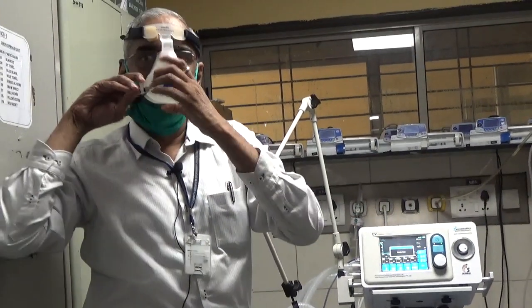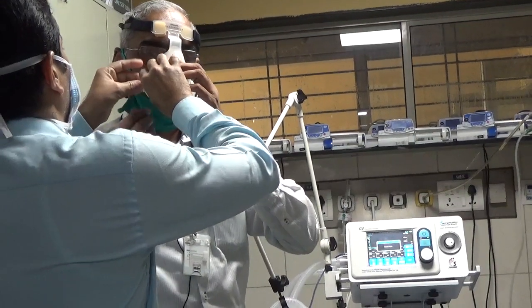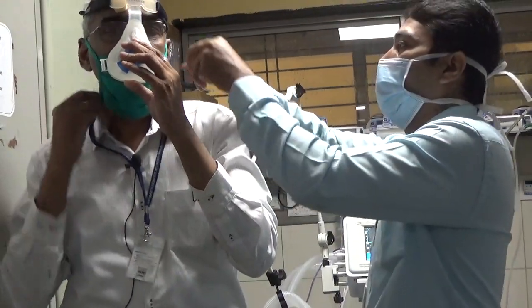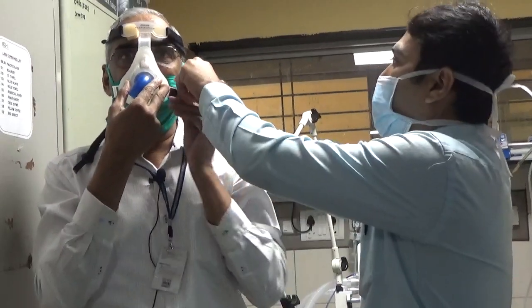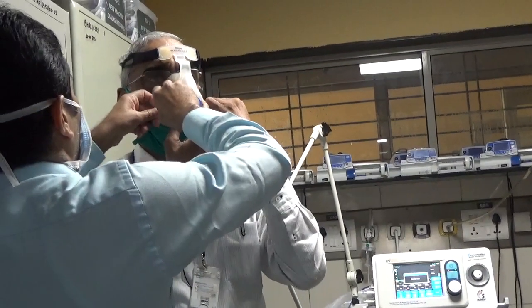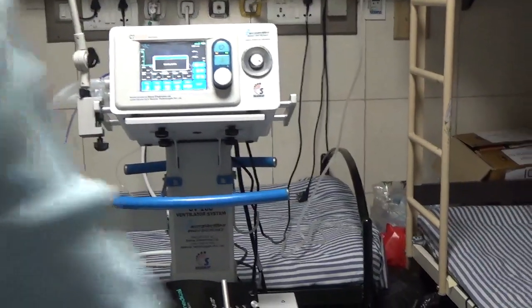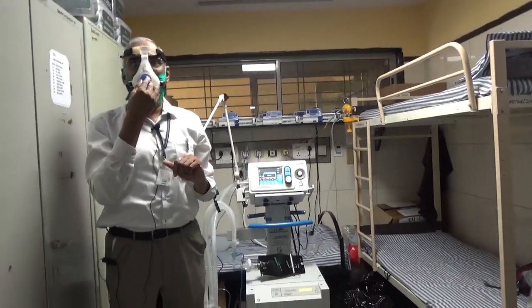Satyajit, can you come here? Okay, give that to me. Put this from this side. You see, why you need an assistant is because someone needs to hold the mask in place and the other person needs to tighten the strap. And this, of course, needs to be explained to the patient as well. And now you see the mask is fitted tightly, but not very tightly, and it is quite comfortable.